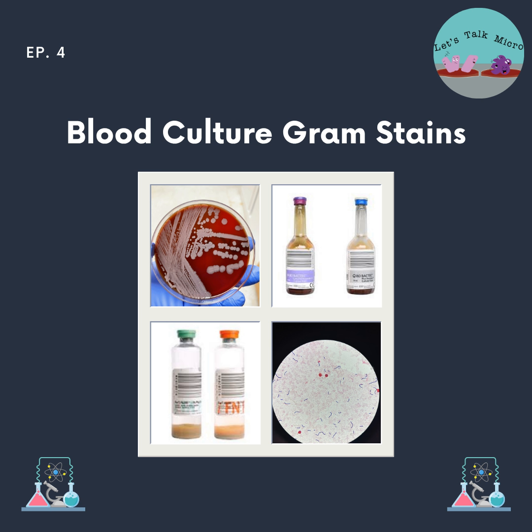Consult with a tech, repeat your smear. If you're not sure about that, then just go ahead and report as gram variable. And then once it grows on the plate, you can adjust your report. That's perfectly acceptable. Don't commit to something that you might be wrong about in the end. Treatment options are different for gram positive versus gram negative. Also, if you're not sure about the arrangement, do not commit either. For example, if you're not sure if it's cocci in clusters versus cocci in chains, just go ahead and report as gram positive cocci. Once it grows on the plate, you can adjust your report.